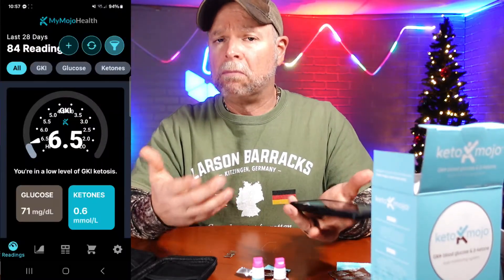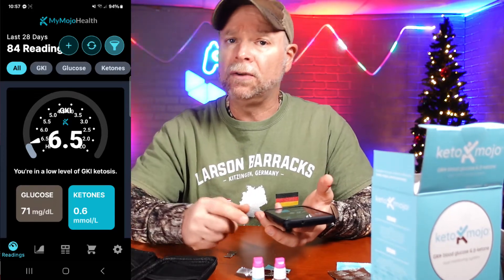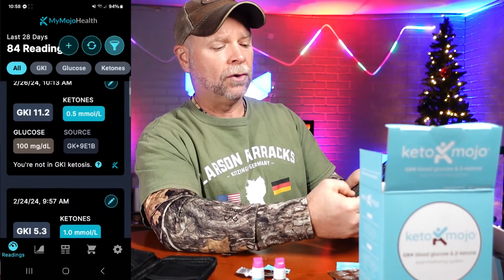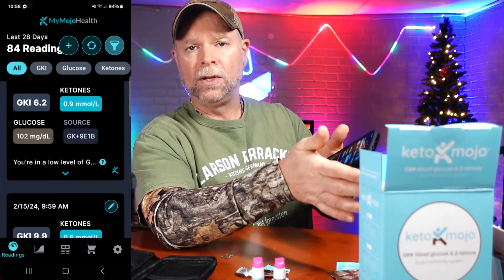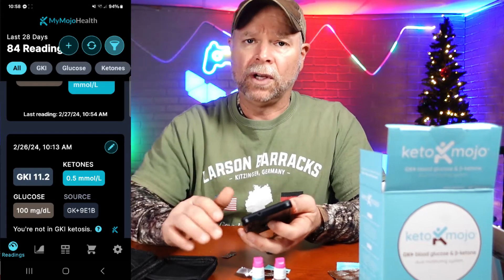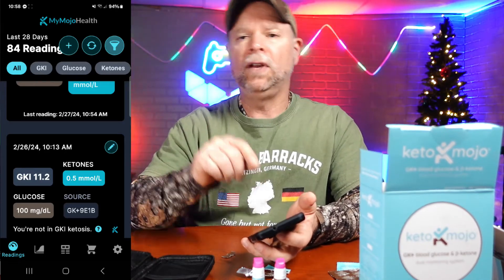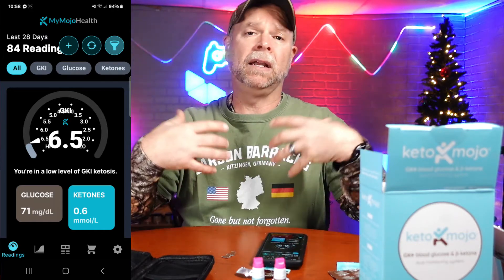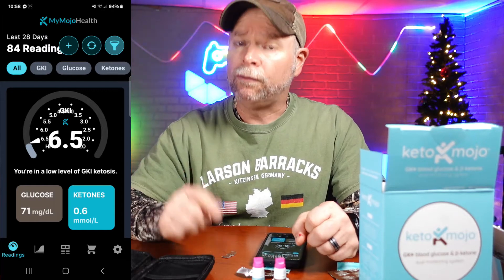If you're looking to monitor your glucose and your ketones and you are on the keto diet, then the Keto-Mojo is definitely the way to go — highly recommended by the top professionals in the field. You can scroll through and see all of your previous recordings of glucose and ketones, and that's going to give you a baseline. If you go to the Keto-Mojo website you can also see these recorded on a desktop app, which gives you graphs of just your ketone reading, just your glucose reading, or a graph of the GKI.